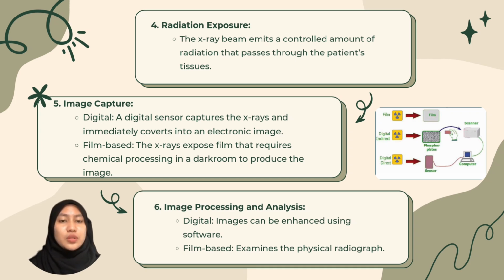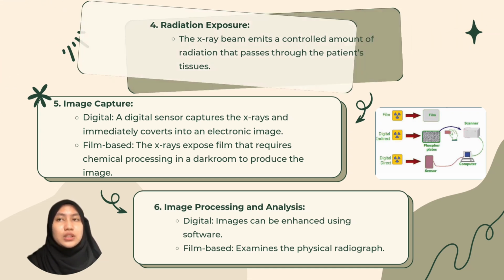So as we know now, digital methods are the standard in most clinics due to their flexibility and efficiency. So after all, together all these steps form the backbone of modern dental imaging that enables accurate diagnosis and effective treatment planning for the patient.